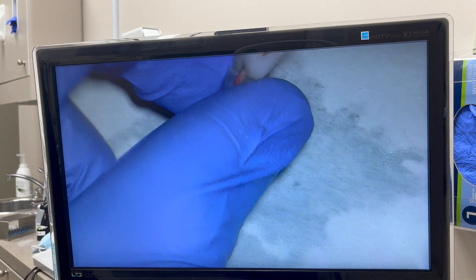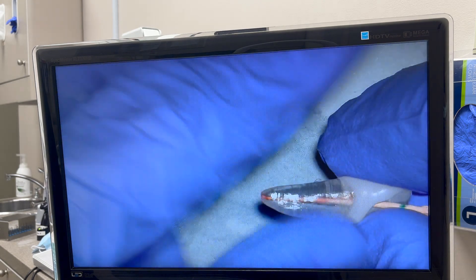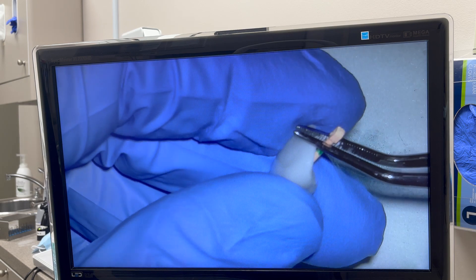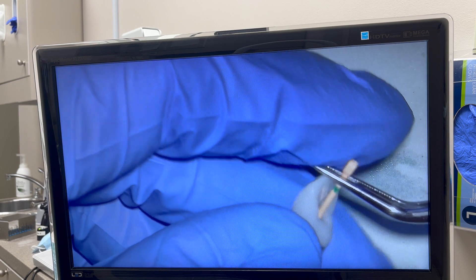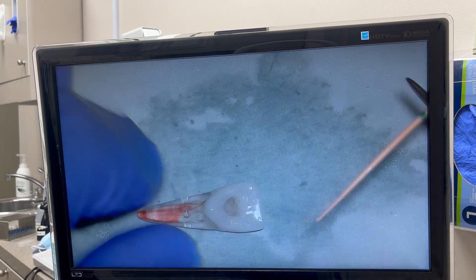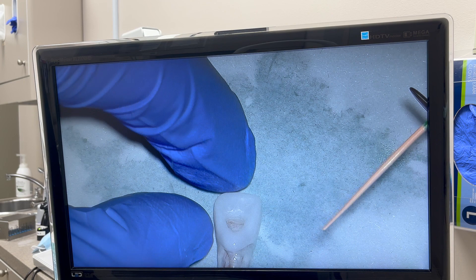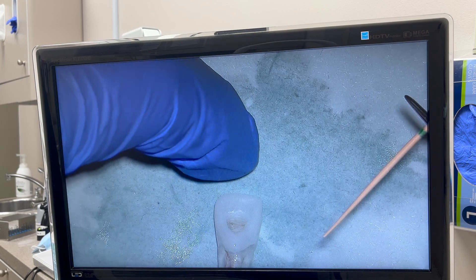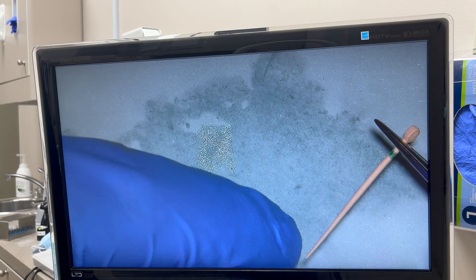Now that we have our gutta percha at 24 millimeters, you're going to grab it at your reference point and you should have 24 millimeters after you adjust. Now we need to cut 14 millimeters from here — that's how much is going to go inside the canal — because the length is 24, the coronal crown part is 10 millimeters. So if you cut the 10 out of the 24, we're going to have 14 millimeters inside the canal. So I need 14 millimeters from the tip of the gutta percha.